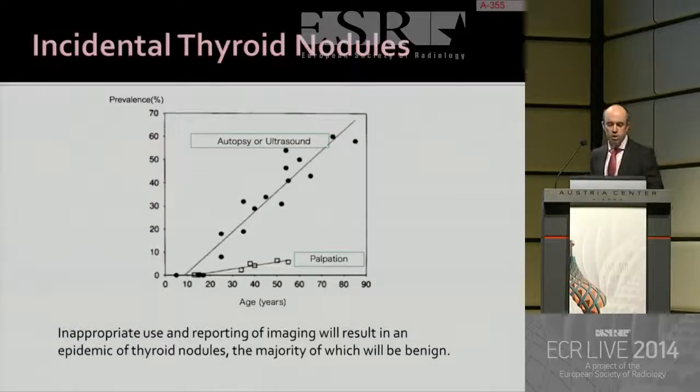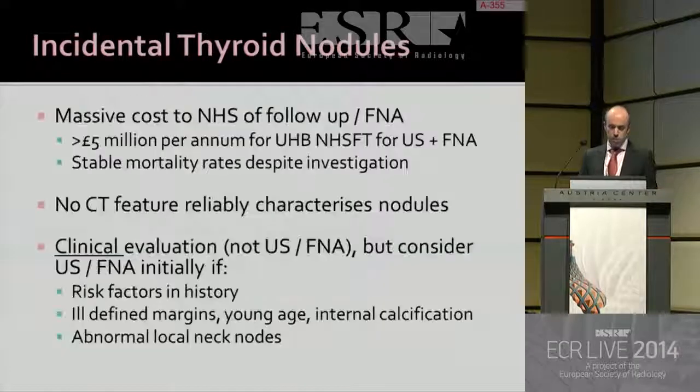So finally, we're just going to briefly cover incidental thyroid nodules. So, as we said before, with the exponential increase in CT and MR imaging and the high prevalence of thyroid nodules on ultrasound, these are very, very common. Okay? And if we start suggesting ultrasound and FNA of all these incidental nodules, that is just too much work for radiology departments internationally.